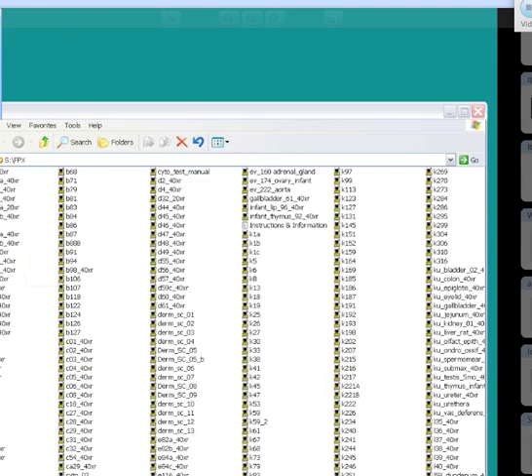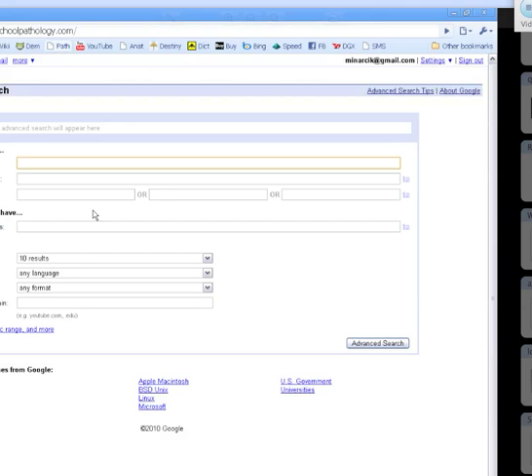My normal appendix is not here unless I look over here. Hold on for one second. I'm going to find this thing, because you can't really start to show a bunch of abnormals unless you look at the normals. So I'm going to find the number for the normal appendix, and we're going to do this the right way.